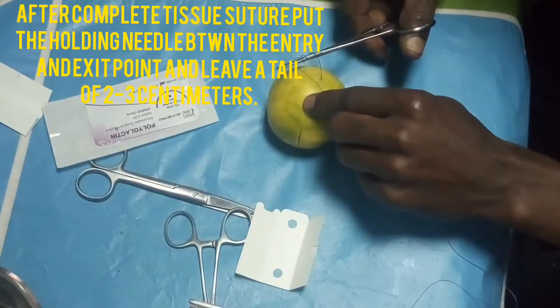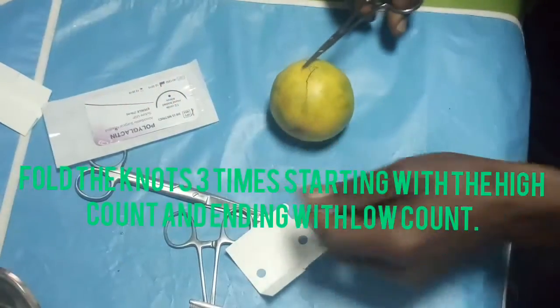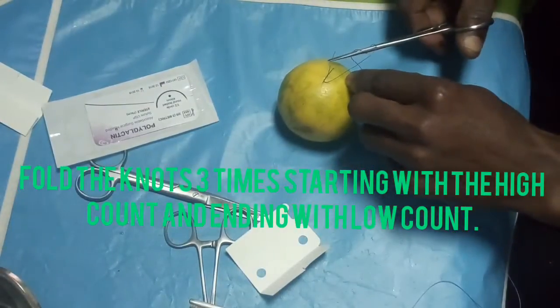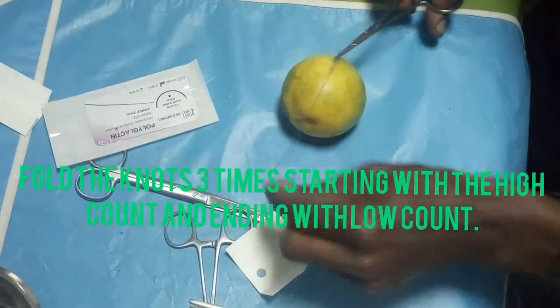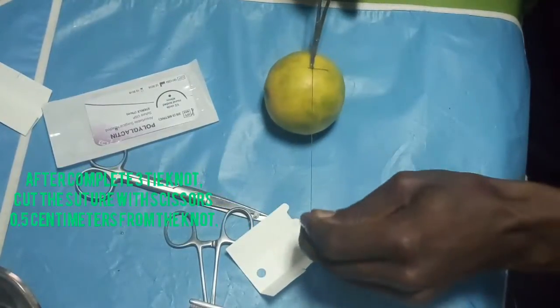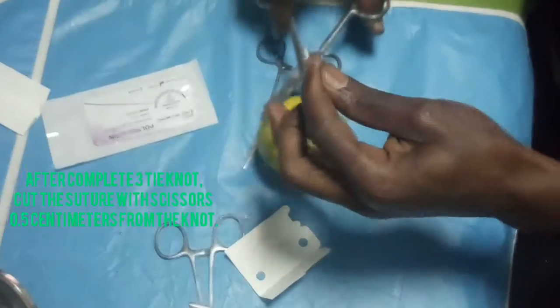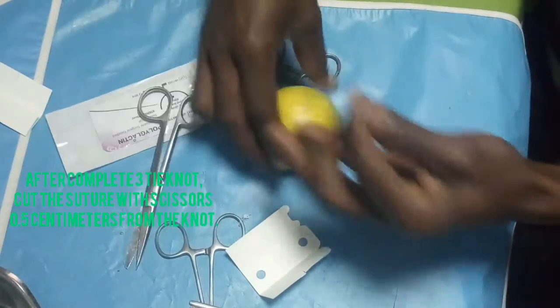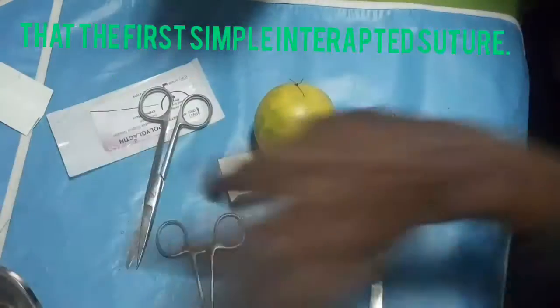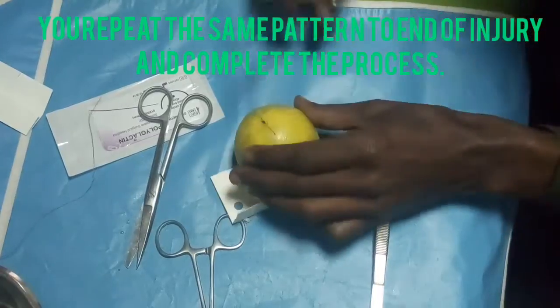Then for a few centimeters, you fold like this. The second, count 1, 2. Then you hold that. The last one, 1. So you use the scissors to cut. So that's what's called the simple interrupted suture. We make the second suture.